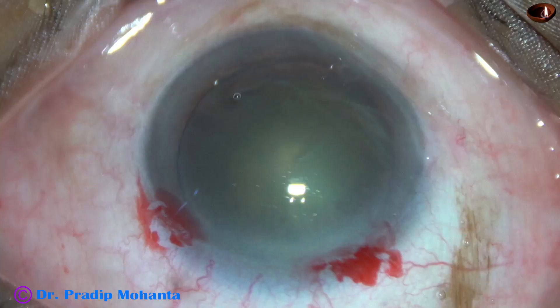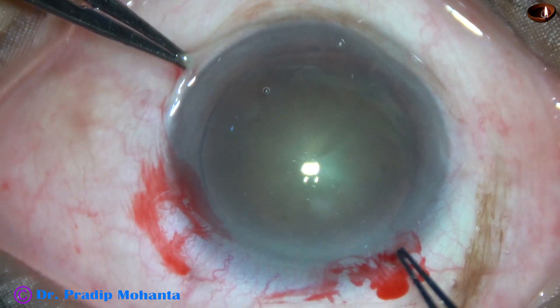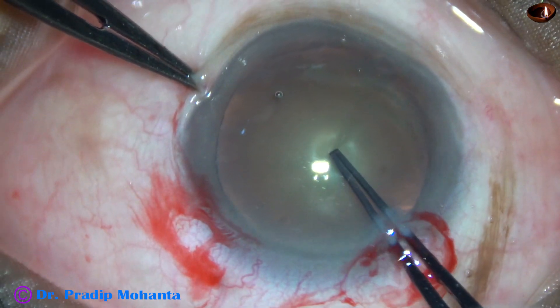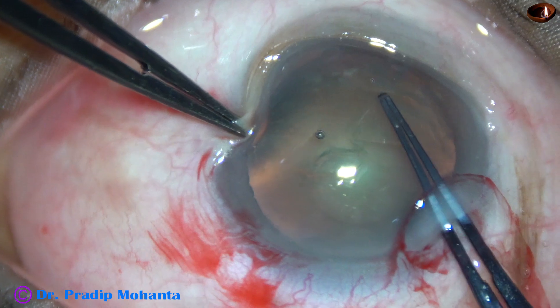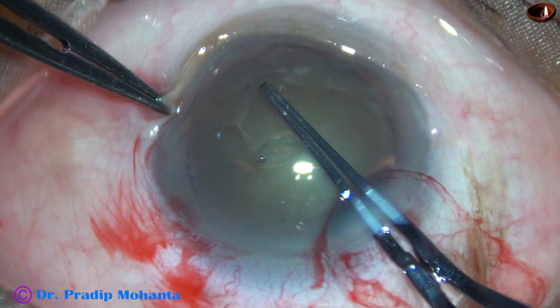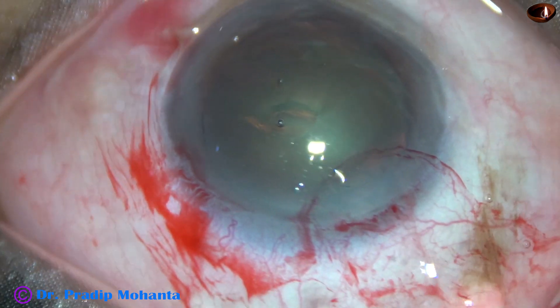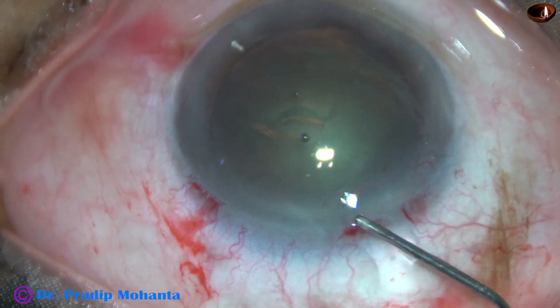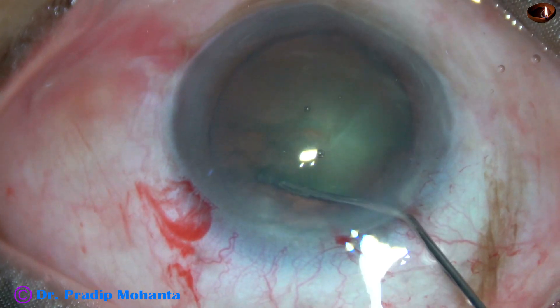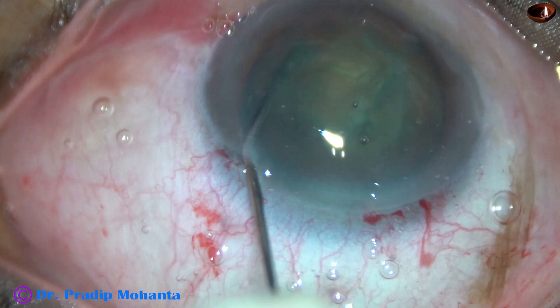Now let us see the second case. By this time, the main incision and side port have been made. Viscoelastic has been injected into the anterior chamber and applied over the cornea. Now the rhexis is being done with Utrata forceps. Red glow is not good, but we can see the capsule very clearly because of the viscoelastic applied over the cornea. Another way is to apply trypan blue dye to stain the anterior capsule and do rhexis. So if we don't have a stereo coaxial microscope, this is the way.